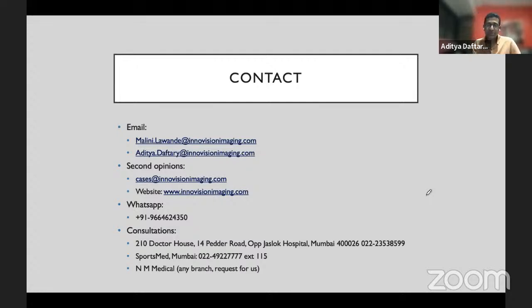Regarding lower Tesla MRI machines working in the periphery, I have to say that in general, for 99.99% of things, a 1.5 Tesla scanner with well-done images is just as good as a 3T scanner. You just have to make sure that people are doing good quality images. I'm happy to have people reach out to us and we can help them get better quality images.